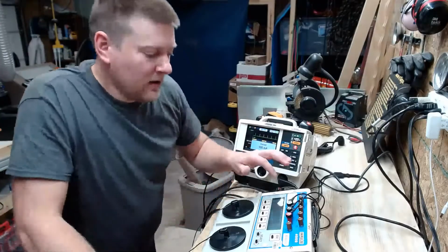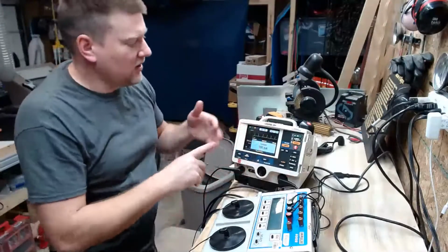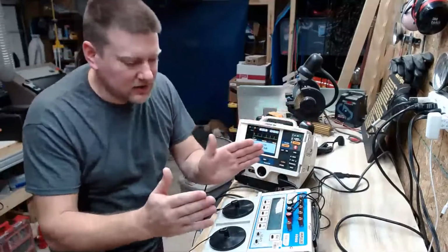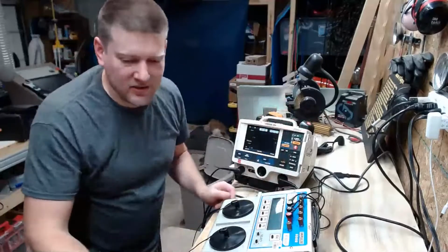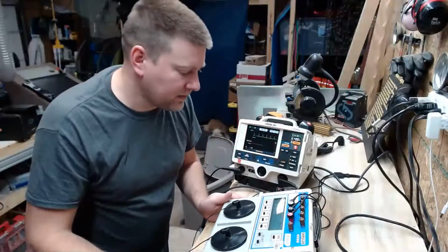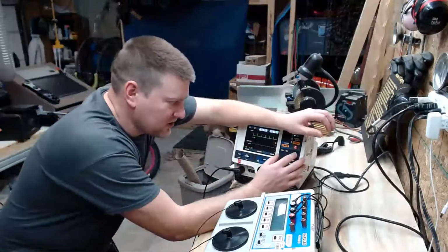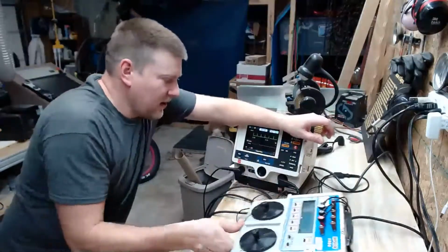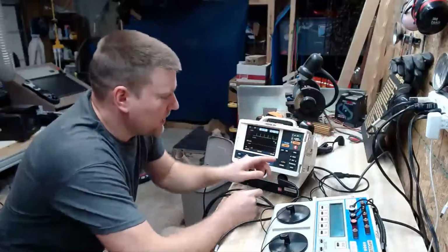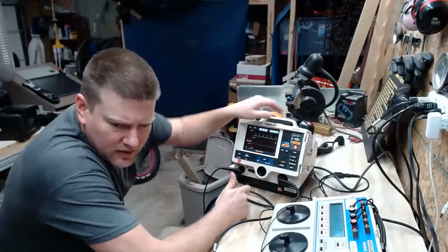Generally, when you're working with ESUs, defibs, whatever, if you need a percentage, always take it to 100. And then from there, you instantly know what your percentage of deviation is. So that's the main functionality of the pacer. Now there are a couple other really important things. So we have this. Let's see. You see this little pulse right here? I hope that's picking up.